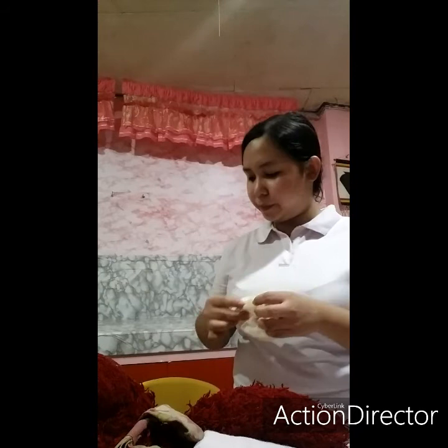And now, remove gloves and discard properly. Then, wash your hands. Don't leave the medication unattended. Then, after the procedure, write the documentation of the procedure we've done, including the dosage, the patient, and the time we've done these injections.